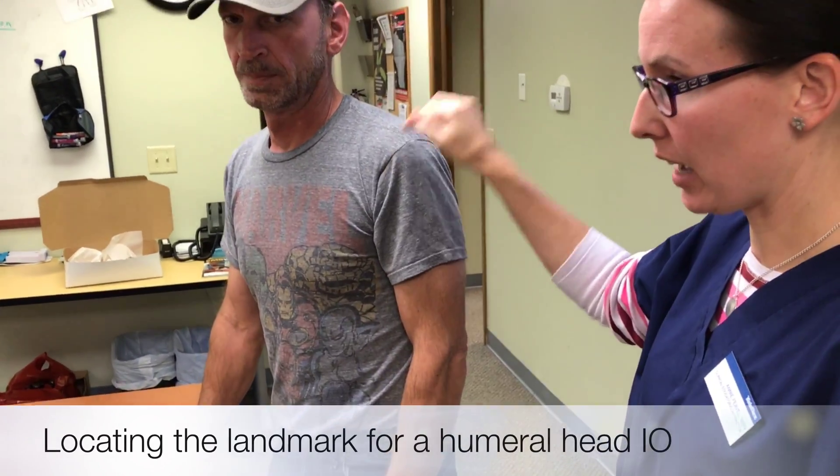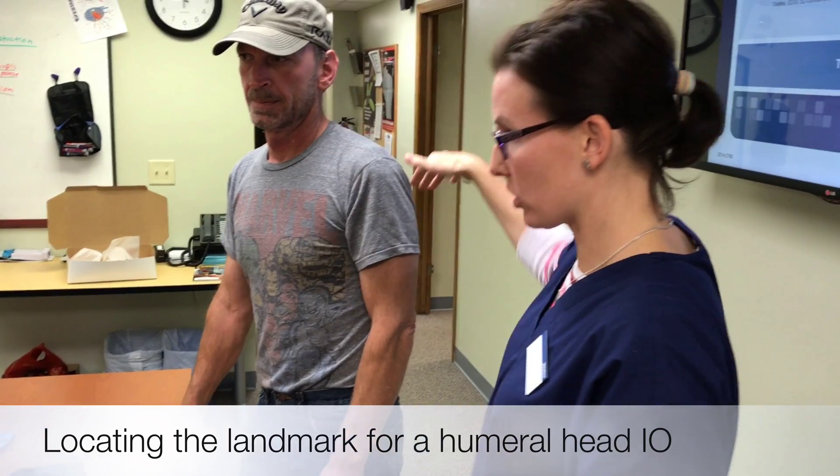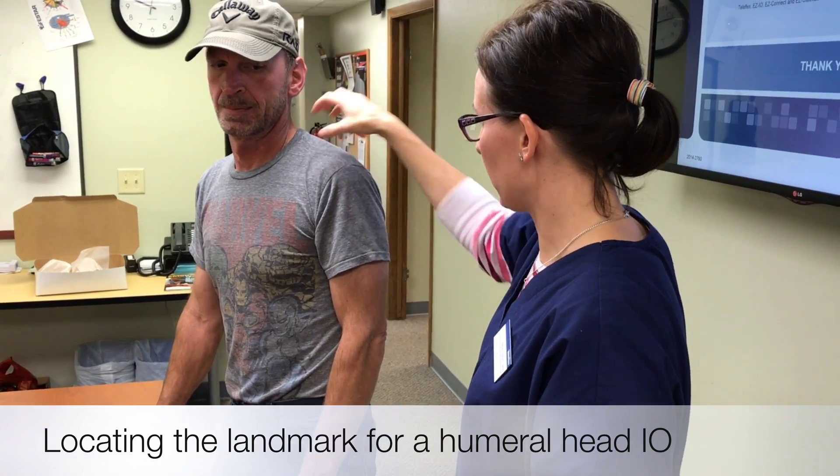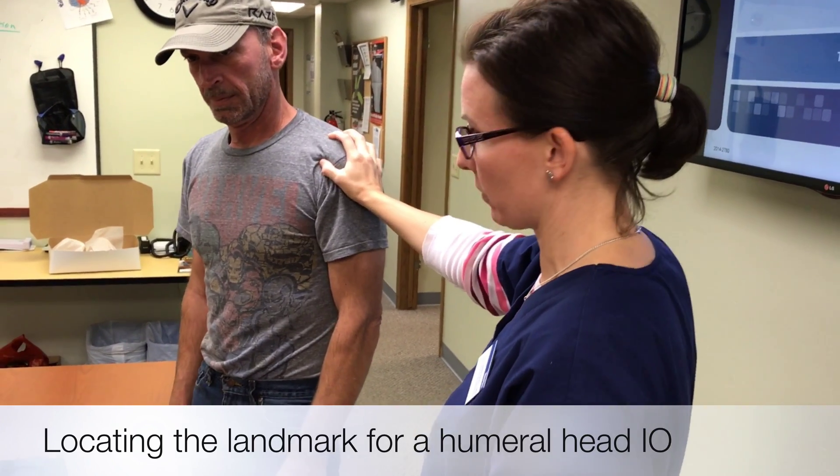The first thing you want to do is find the shoulder. Obviously his is pretty obvious, but you get some folks with extra tissue and it might be hard to tell where the shoulder actually is. So first thing: find the shoulder.